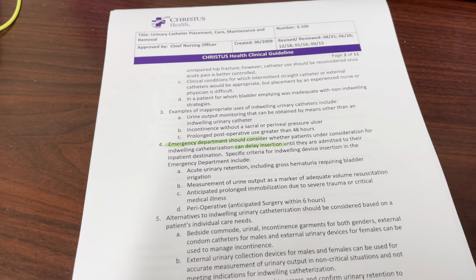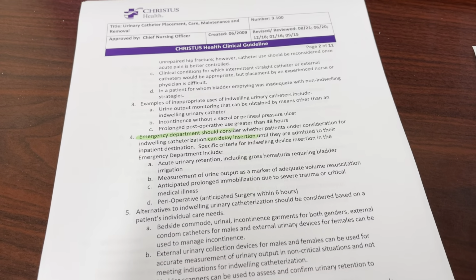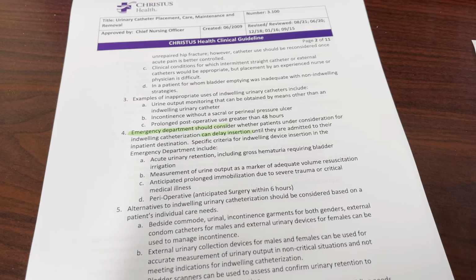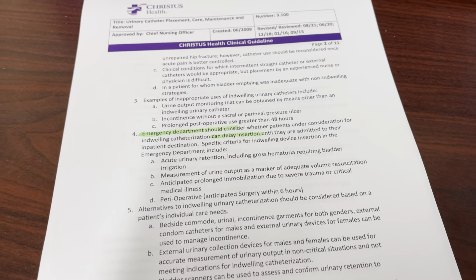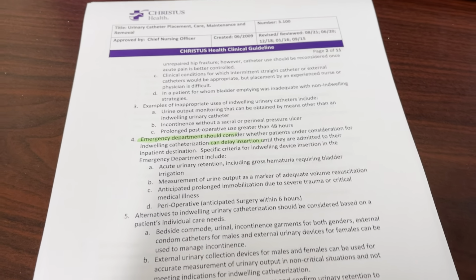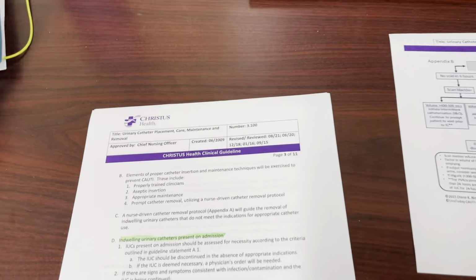There's a higher risk of contamination, and so in the protocol it actually states that they should delay putting the Foley in there unless they have to put it in because of a specific criteria that is pressing and that they have to have it placed immediately. And so our goal is to not have Foleys put in the emergency room if we can avoid it.